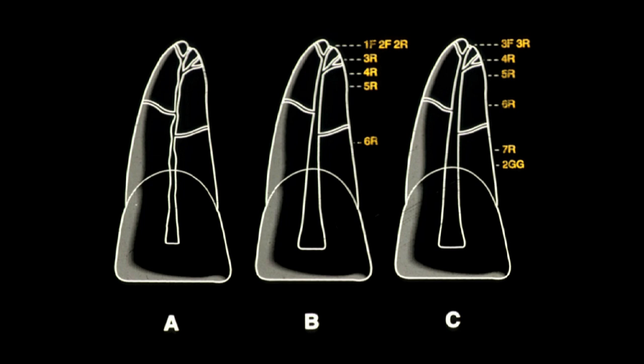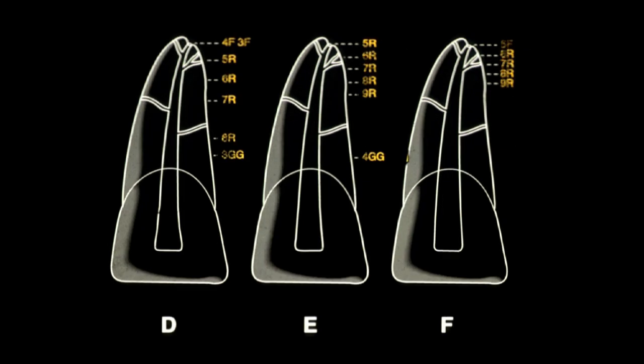On the outstroke. When you think about it, it's the only dentistry ever done on leaving the patient, in a way. But we'd carve on the outstroke and then go to the next reamer, and then we'd go to C. We would recapitulate, sequentially re-enter all those files, and as you did that, D, E, and F, finally a reasonable shape existed. But we didn't have a way to completely smooth it out.